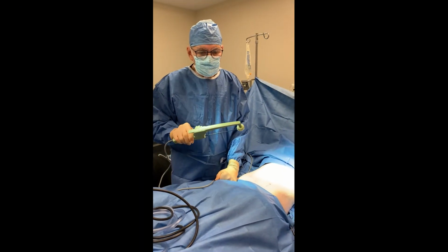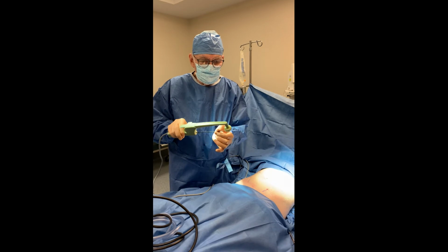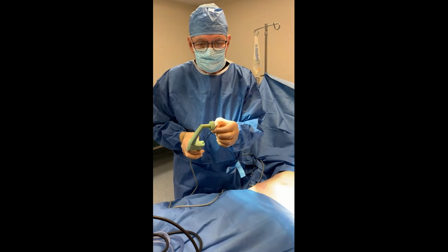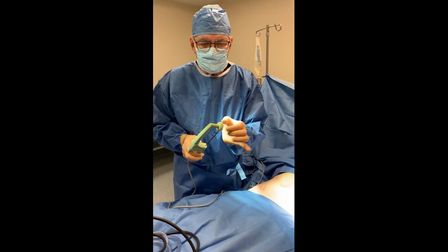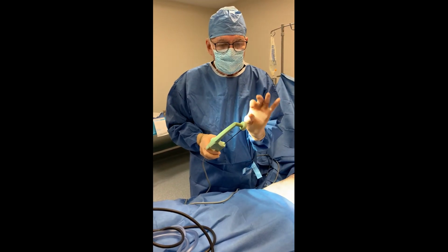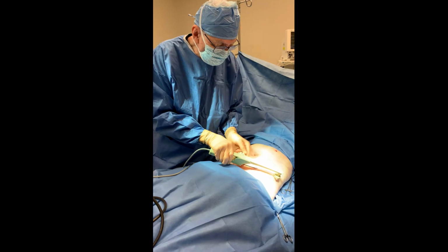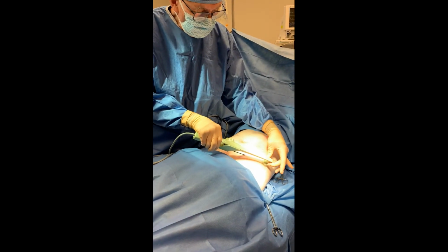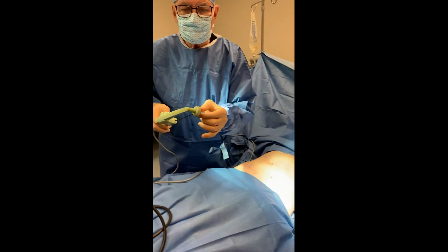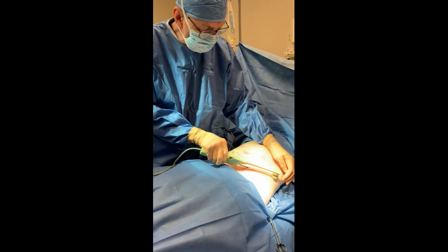All right, so now we're in the operating room, and this is the BodyTite device. As you can see, this is the probe that emits the radio frequency energy. And the advantage of this is that this energy is emitted only through this section of the probe. So it's very accurate and precise. Secondly, when the probe is put underneath the skin, this portion registers the heat and the amount of energy that's being transmitted underneath the tissue to the underlying area.